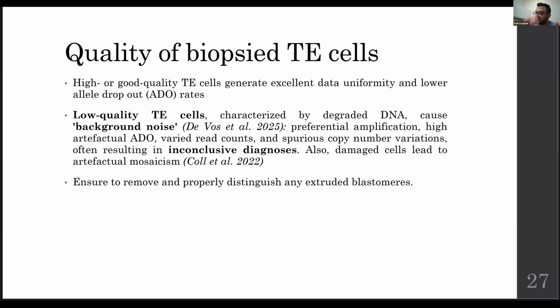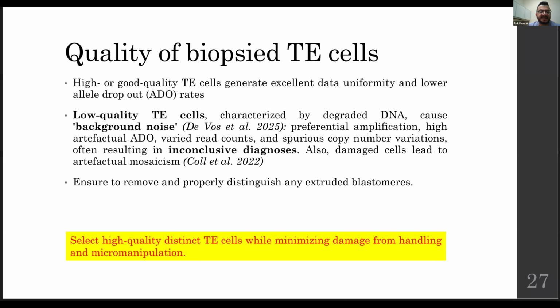Also, cells damaged by the laser or during manipulation lead to artifactual mosaicism. So please ensure to remove delicately and properly distinguish any extruded blastomeres. Take-home message: select high quality, distinct trophectoderm cells while minimizing damage from handling and from micromanipulation.